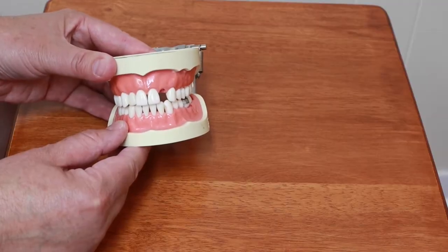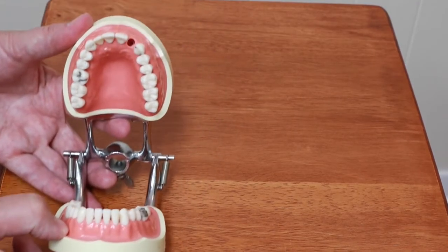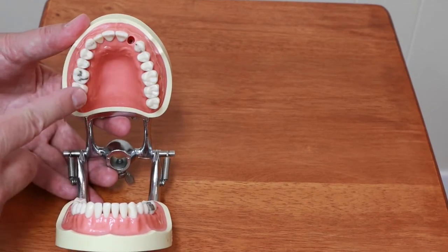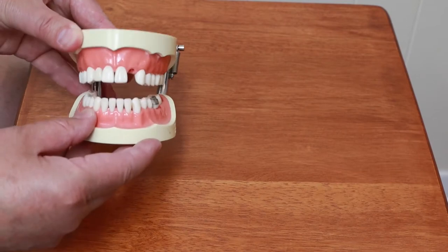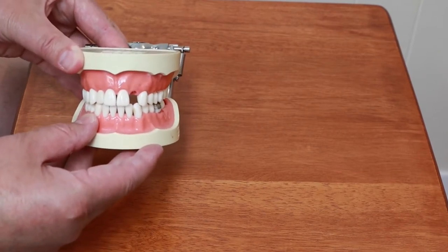I'm going to take impressions of this. Basically it's going to consist of an impression of his upper teeth, impression of the lower teeth, and then a bite registration that shows the lab how the teeth fit together.